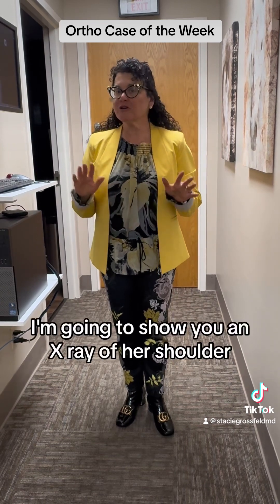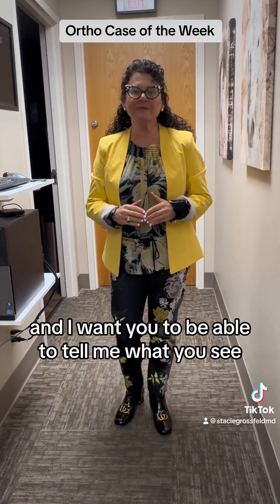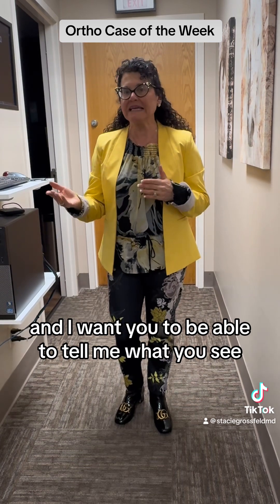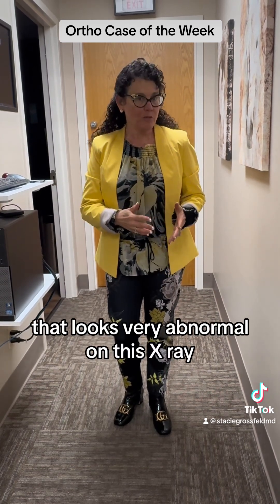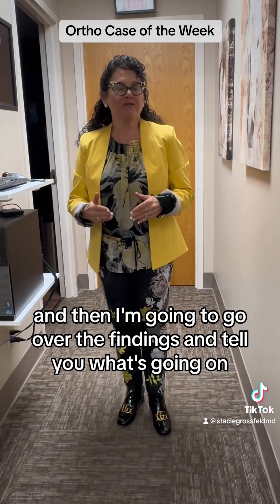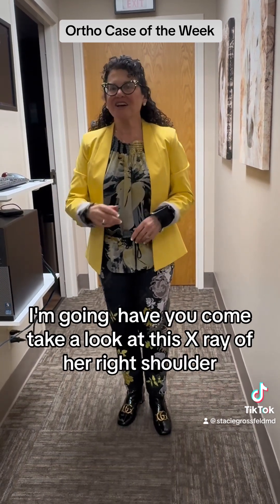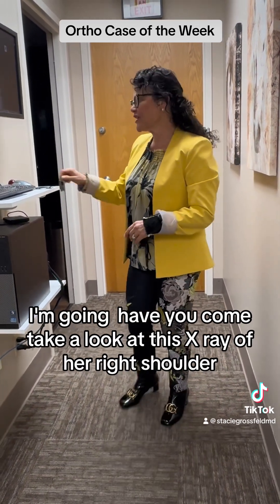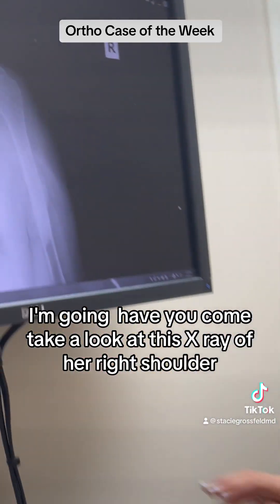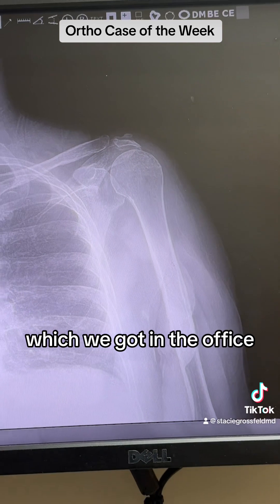I'm going to show you an x-ray of her shoulder and I want you to be able to tell me what you see that looks very abnormal on this x-ray, and then I'm going to go over the findings and tell you what's going on. So we're going to take a look at this x-ray of her right shoulder, which we got in the office.